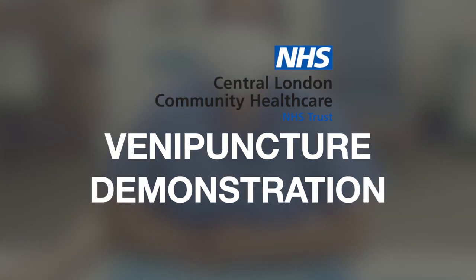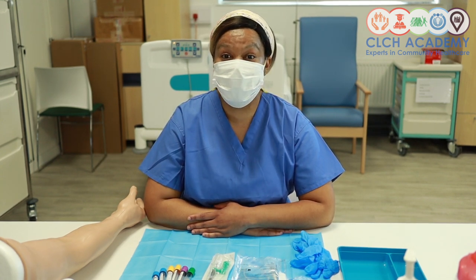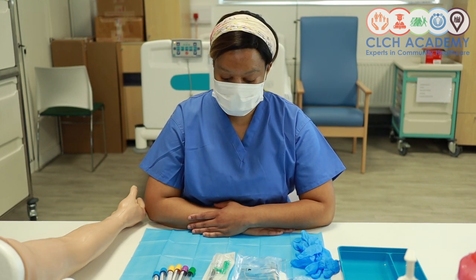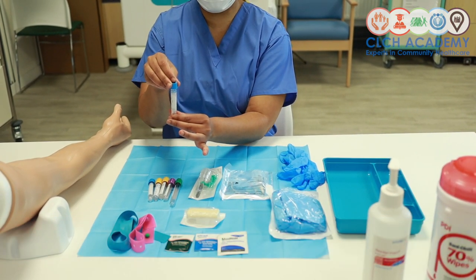We're going to be doing a short demonstration on how to take bloods or do venipuncture for the patient. I would like to start off by introducing you to some of the equipment that we will be working with today. So starting on this end, I've got my blood bottles. I'll bring one up just so that you can see that.